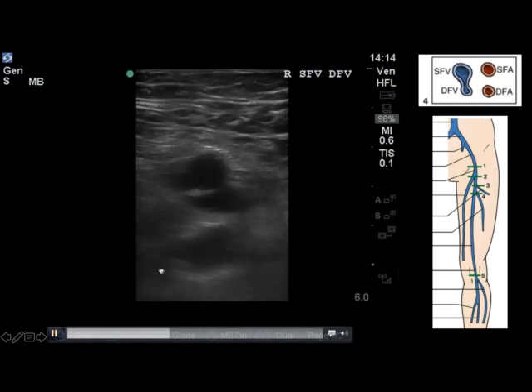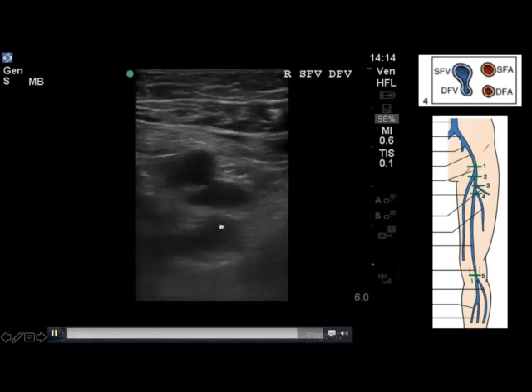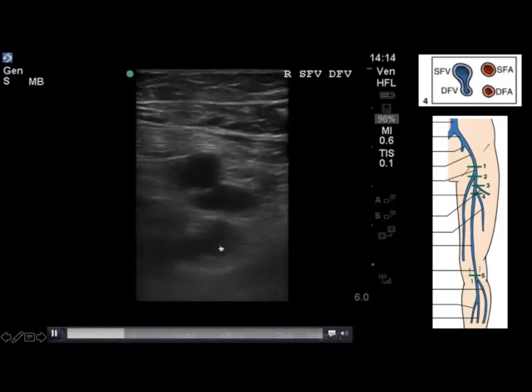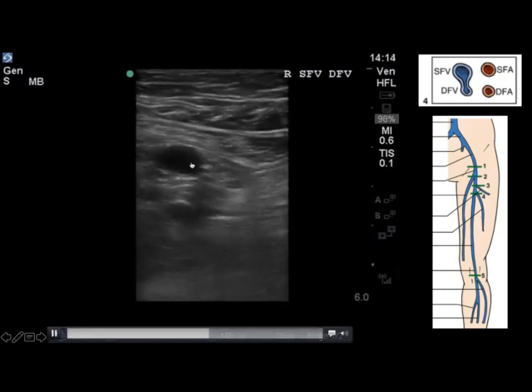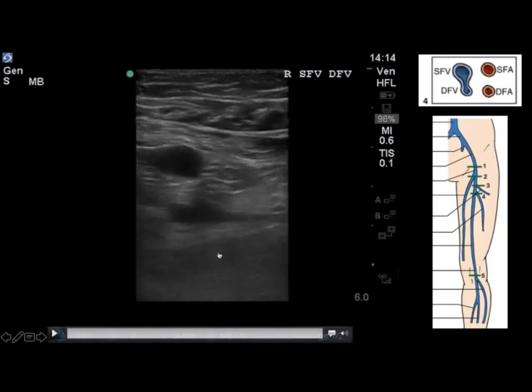The next thing we look at is the superficial femoral vein and deep femoral vein bifurcation point. A little bit superficially you have the superficial femoral vein; deep to it you have the deep femoral vein. We're able to compress all of the venous walls together, confirming that there is no clot present at this key site.